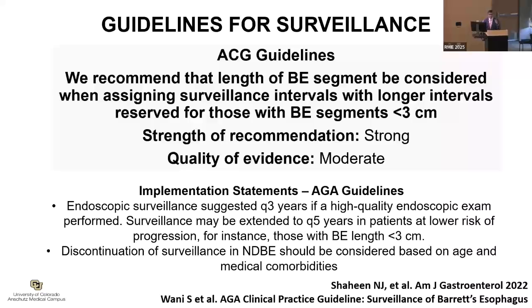And this is where, again, misuse of endoscopy can happen. You heard Dr. Pohl talk about this. When you bring patients back for endoscopies that are not indicated, we see this happen way too often. When I see patients in my clinic, they tell me that they've been undergoing endoscopies every year. Then my brain starts ticking. Maybe these patients have had dysplasia in the past, and that's why the endoscopist is bringing them back on an annual basis.